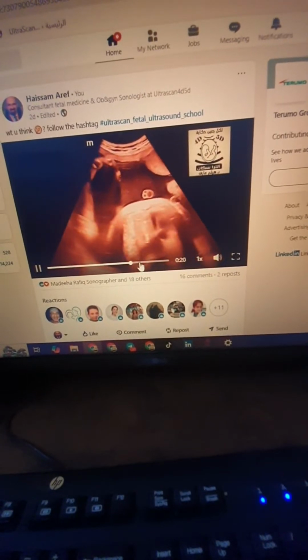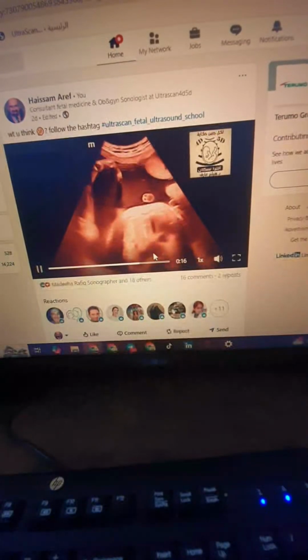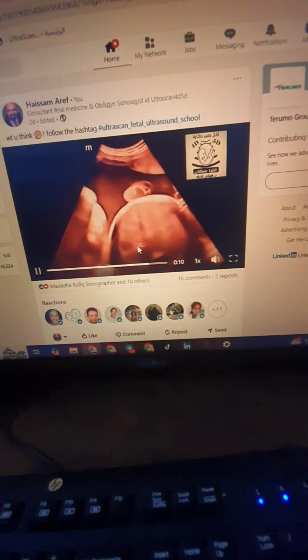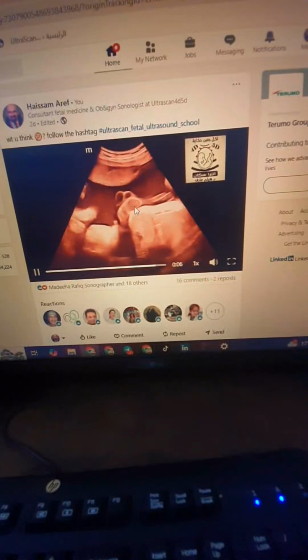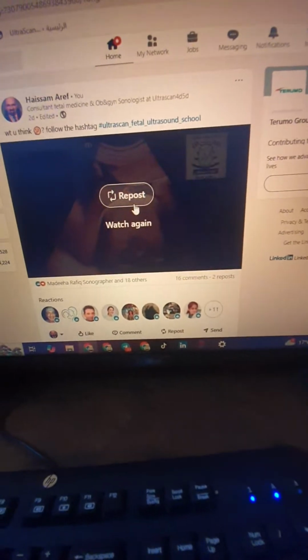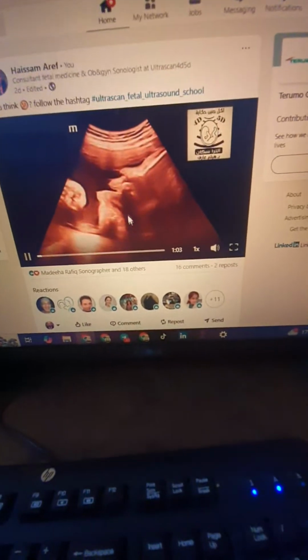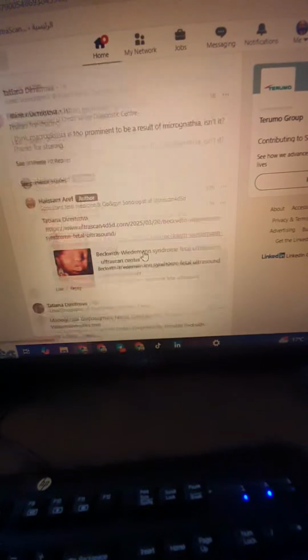And also you will notice the diaphragmatic hernia, where the stomach is in the chest together with part of the liver and part of the bowel. And this is the omphalocele that we have been talking about. So it's a case of diaphragmatic hernia associated with omphalocele and associated with a protruding tongue, and we can call it Beckwith-Wiedemann syndrome, my friends.